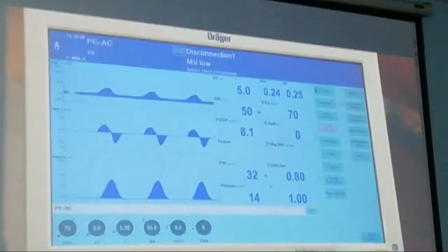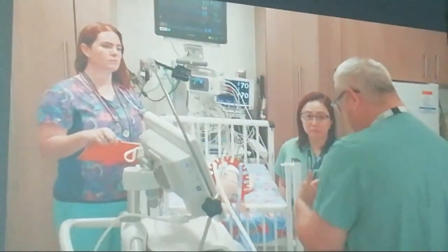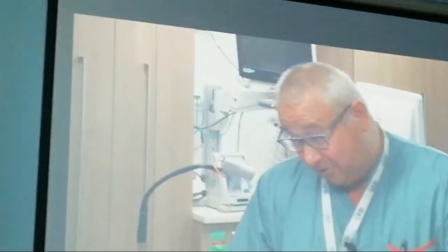So let us see that with Prof, and also we'll get more hands-on with Ruben and our fancy Draeger machine. And we have the Draeger team at the back ready to help. What we're going to be watching from a respiratory point of view, because we're using volume-controlled ventilation, is if we increase the PEEP and we open the lungs, we should be able to deliver the volume at the same pressure or maybe even lower. So this is why we're not too overly concerned as we're going up on the PEEP, as long as we're watching all the parameters at the same time.